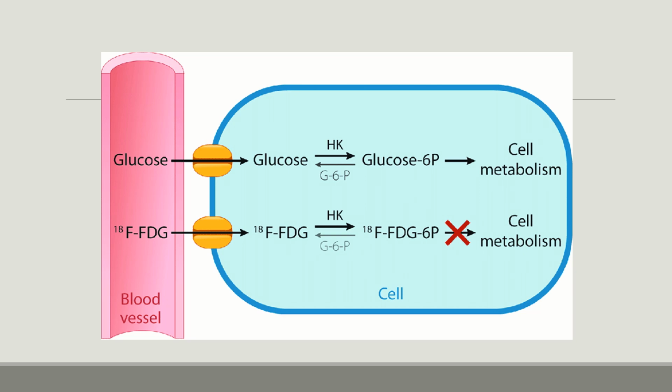The method of localization is facilitated diffusion. It's passive movement across the cell membrane, but it is a selective process.